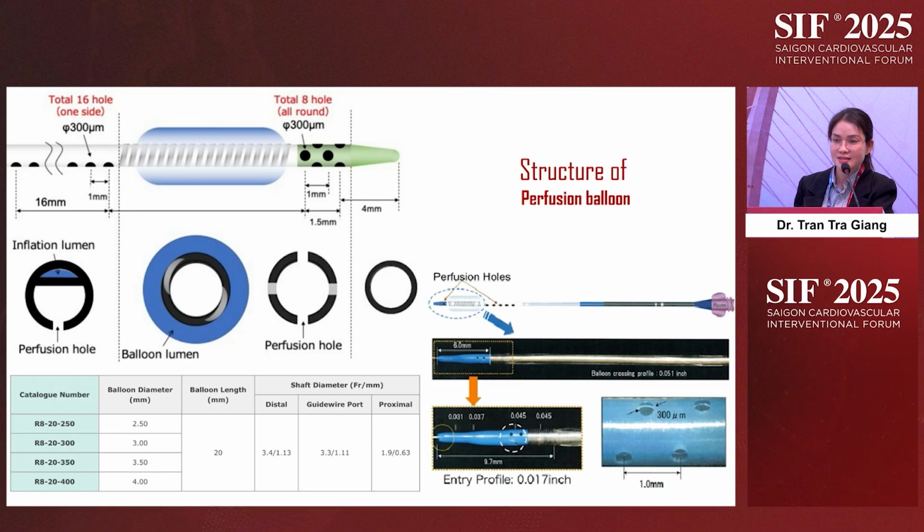In my lab, I have perfusion balloons to deal with perforation, from Japan. I have friends who gave me some balloons like that. And I think maybe I could use the balloon to protect the side branch while I implant the DCB balloon, to prevent ischemia for the patient.